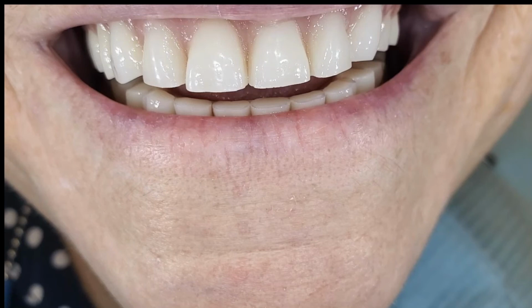Even if I don't necessarily understand Cantonese, I can watch the jaw move to be able to pronounce the building blocks of that language, and I'm watching the jaw posture. And then I'm able to say, okay, how am I going to set the teeth to function within that? So this is the architecture, and again, I love the title. This is the architecture of a denture, of what I've learned.